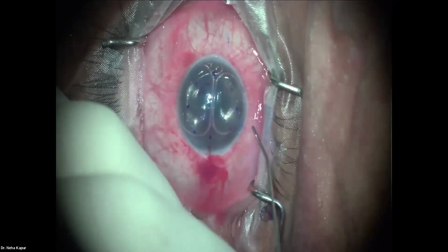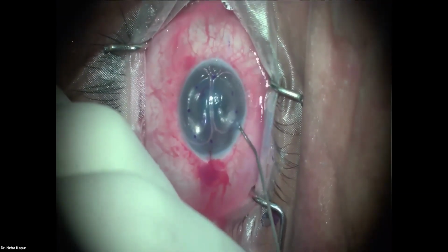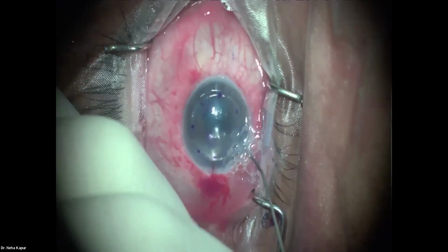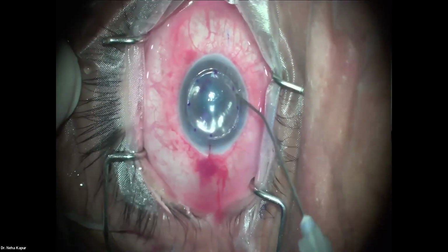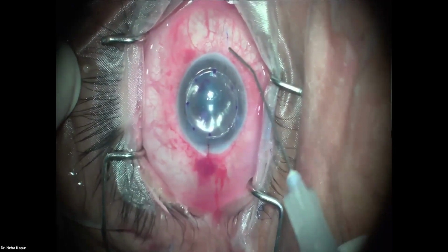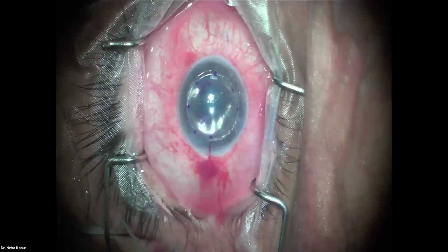So just from the side port, we go in, reach the bubble, and grow the bubble. And it's preferable to have one full bubble rather than small bubbles. And if you all can see, this is the edge of the lenticule, and just outside of it, you can see this other ring. This is what is called the double ring sign. And this shows that your lenticule is stuck well.